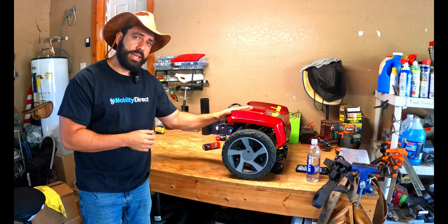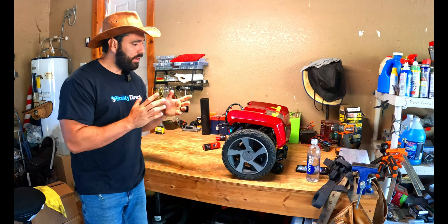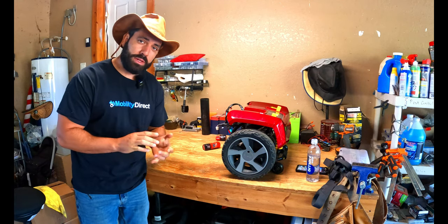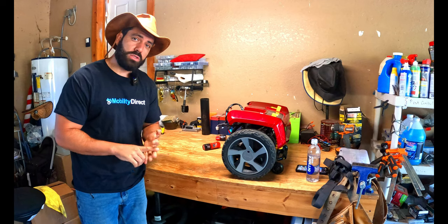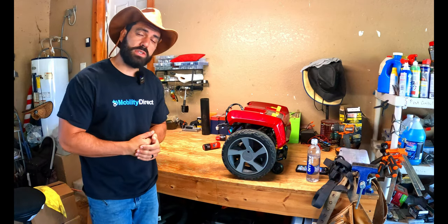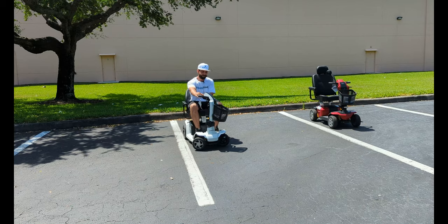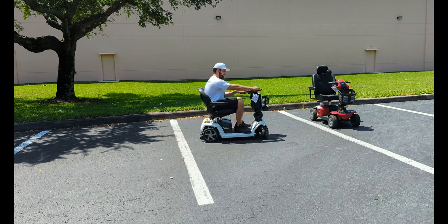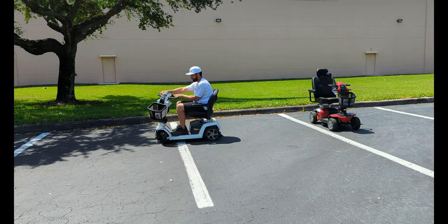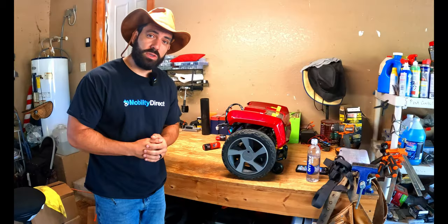In today's video, I'm going to show you how to replace the motors and the controllers on a Pride ZT model, particularly the ZT10. I have the rear base here and the front half of the scooter behind me. I'll show you everything you need to know about replacing the two motors and the two controllers. The ZT models have two motors and two controllers, which allows you to do a donut — taking very sharp turns even though it's a four-wheel model, kind of like a ZT lawnmower where you can orbit in place.